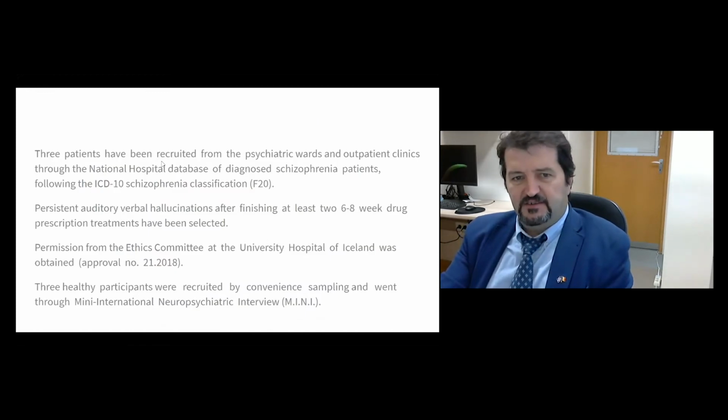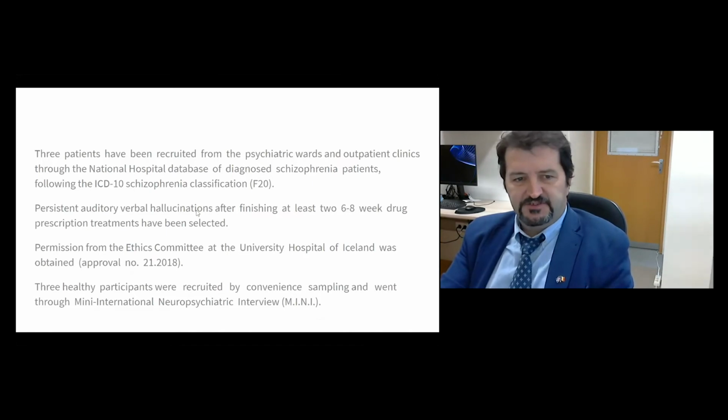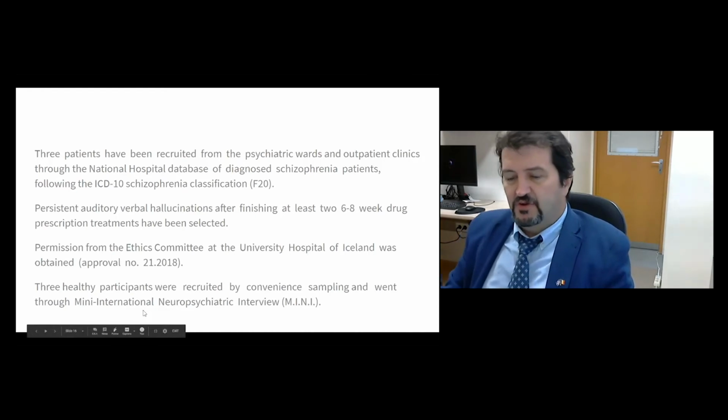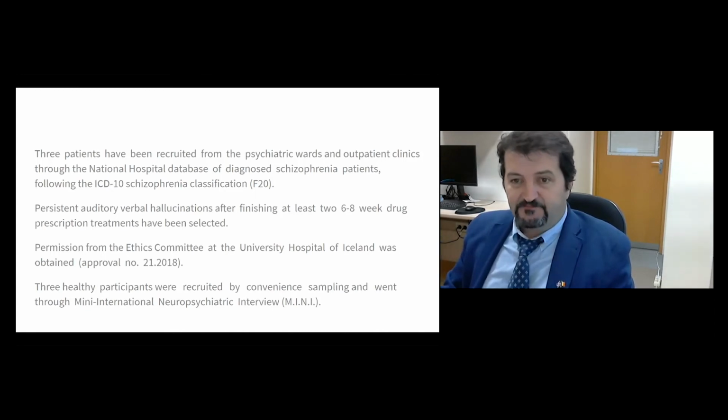The 3 patients whose data we show here have been recruited from psychiatric wards with persistent auditory verbal hallucinations. And 3 healthy participants were recruited by convenience sampling and went through a MINI interview to show that we don't suffer any psychiatric disease.